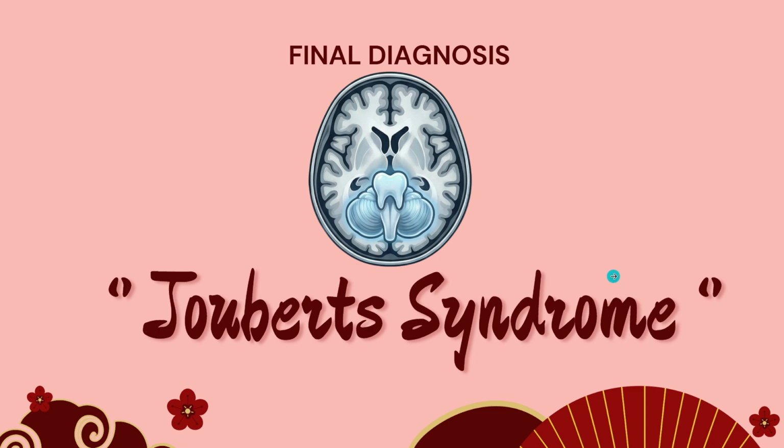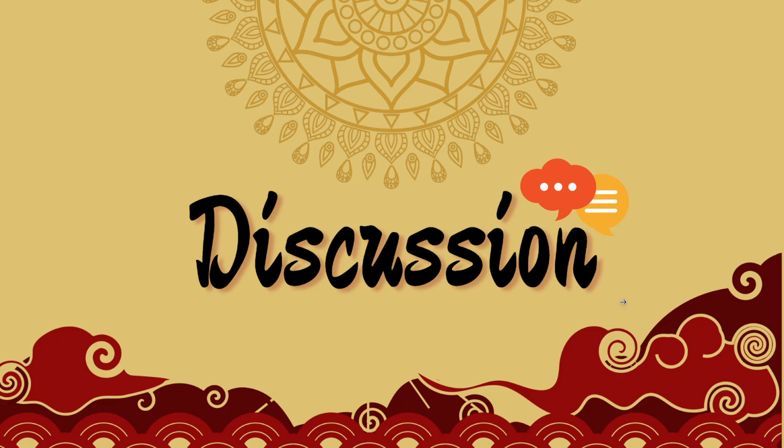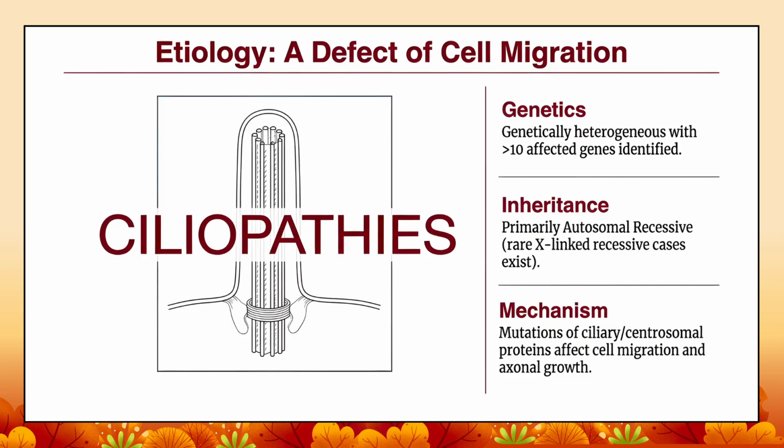On clinical presentation of seizures, global developmental delay and ataxia, and imaging features of molar tooth configuration of the midbrain, hypoplastic cerebellar vermis and batwing configuration of the fourth ventricle, we diagnosed this case as Joubert syndrome. I will briefly discuss about the Joubert syndrome and its related disorders.